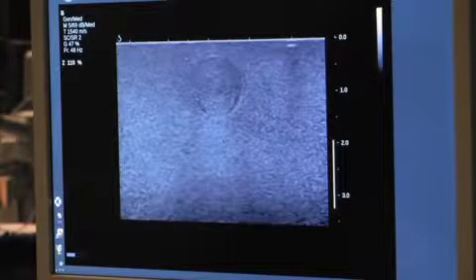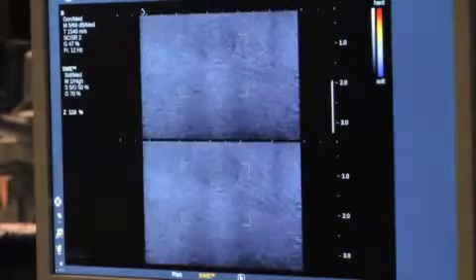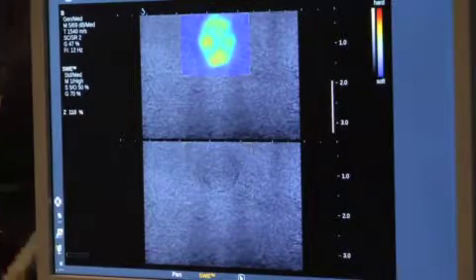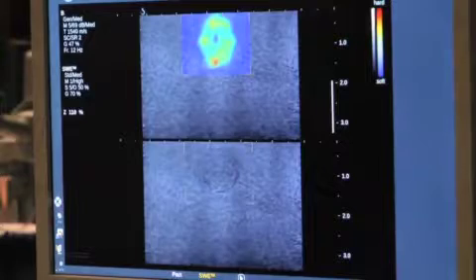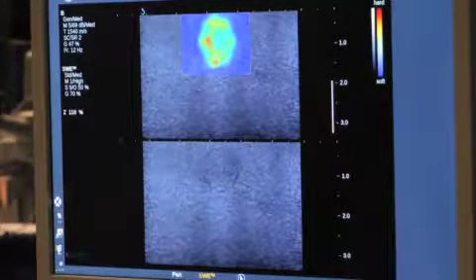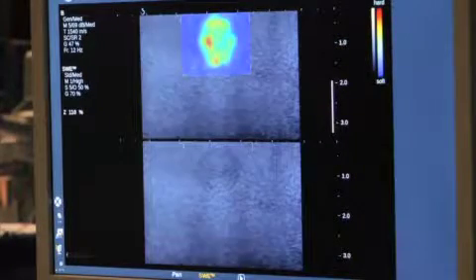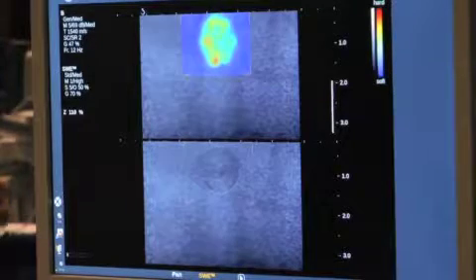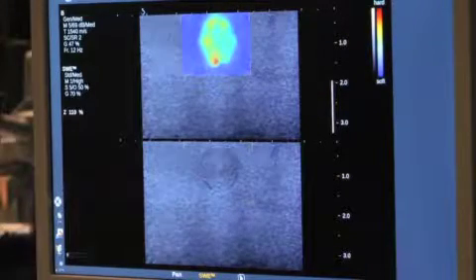This lesion is very isoechoic by 2D and barely visible. When I activate the shear wave, I can see that the lesion becomes much more conspicuous. In this case, the shear wave was very helpful in identifying the lesion, which by 2D was very difficult to see.